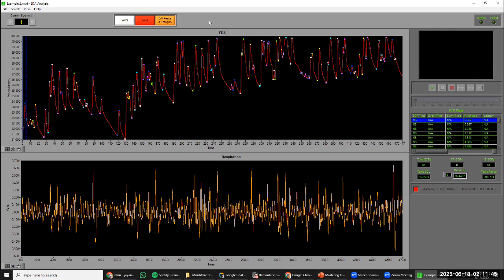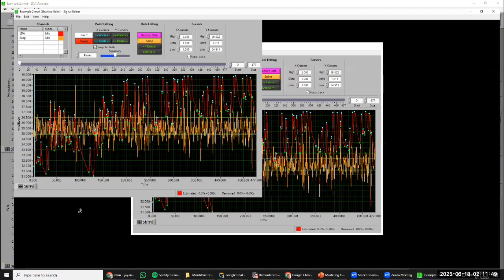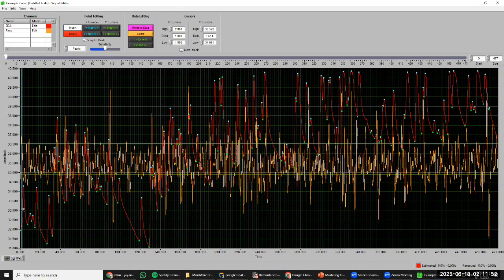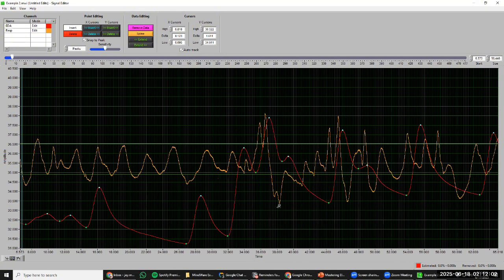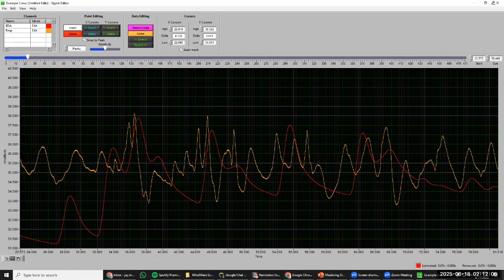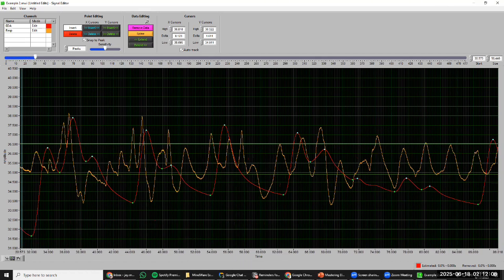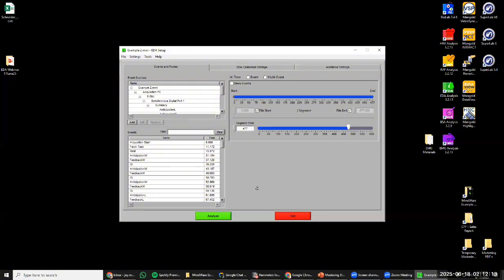It does make the data a little bit harder to handle and identify the different points. We will very likely have to go into the editor to make that correlation, the differences between respiration artifacts and not. But it is certainly doable. So in reporting on SCRs, this is a nice way in which we can ensure, again, that the segmentation is not causing problems for us. Okay, great.